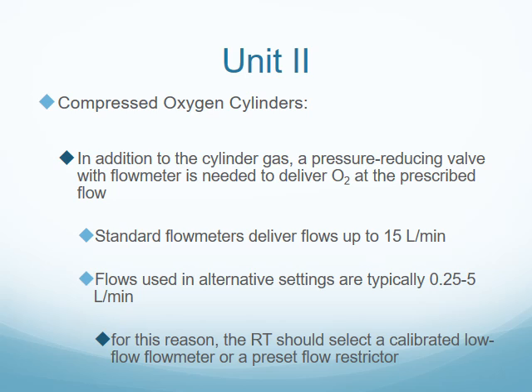They have not standardized a type of high flow system for home. It just doesn't have the source of the pressure needed to maintain one, but they are currently working on some type of prototype for that, but it's nothing concrete. So if a person needs more liter flow than 5 liters, you usually do not see them go home at that point until we're able to wean them down.